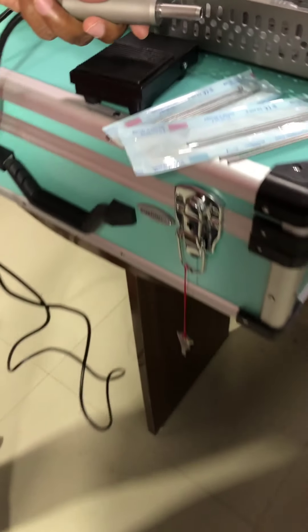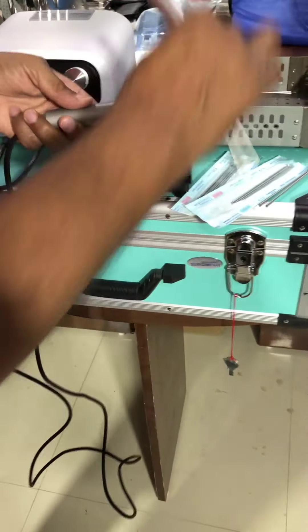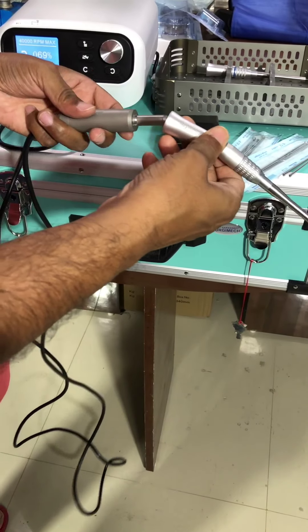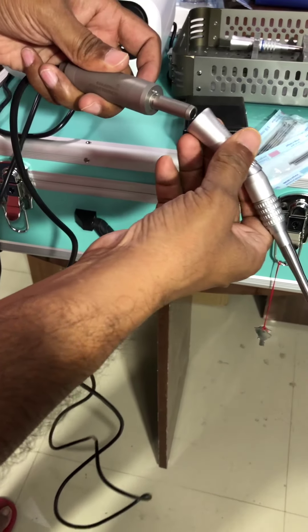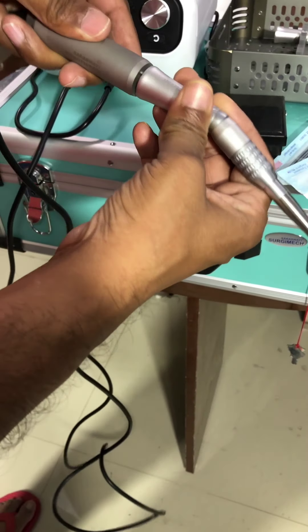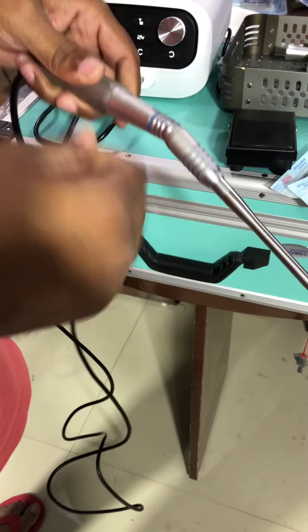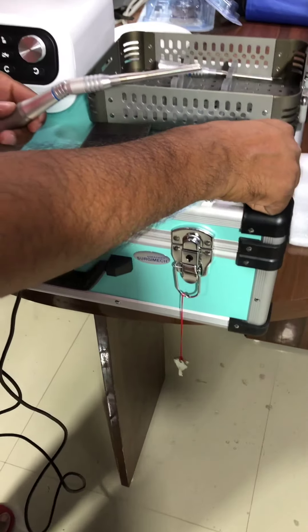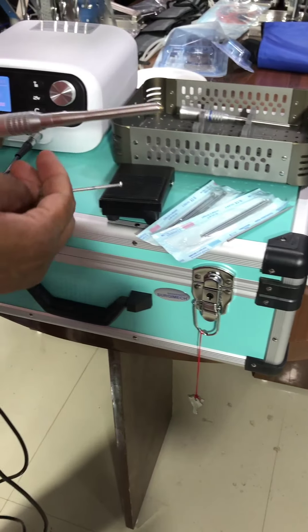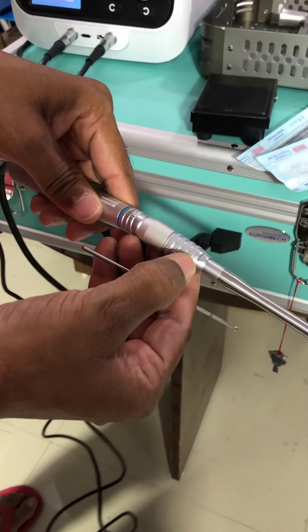This is a motor. This is an angular handle. This is a pin — just press it to lock. Now this is to lock. We are putting this plate. This is an indication to open, and this is closed.